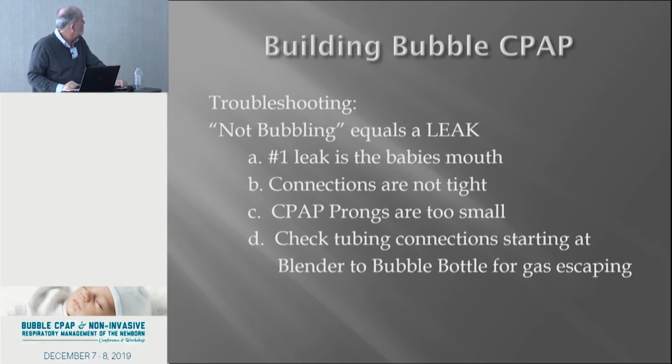The number one leak in my experience is the mouth, and they've talked about chin straps and different things. It's amazing how quickly they learn that if they keep their mouth shut, they don't have to work as hard. I don't know how they figure that all out. They're just wee little things, and their brains are just like an acorn, but they figure it out, that if they keep their mouth shut, they don't have to work so hard. And there's some people that could learn from that.